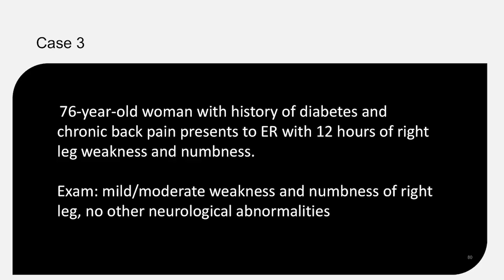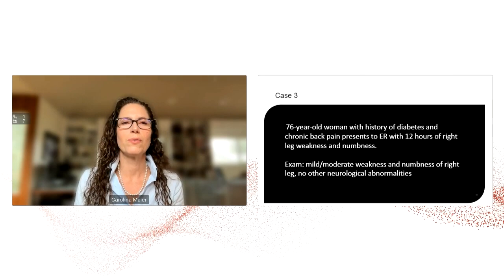So I'm going to go to Dr. Cass here. What would be your differential diagnosis with just this information at this point? And what imaging would you order?